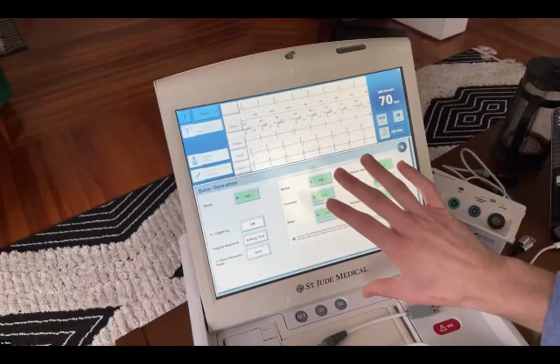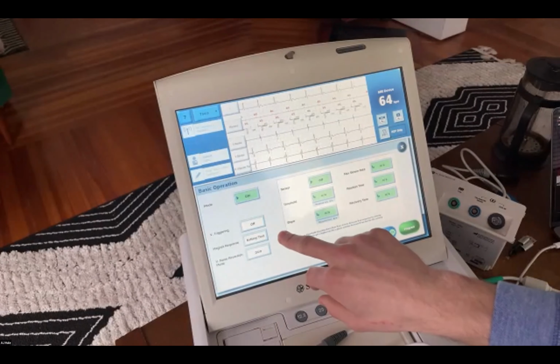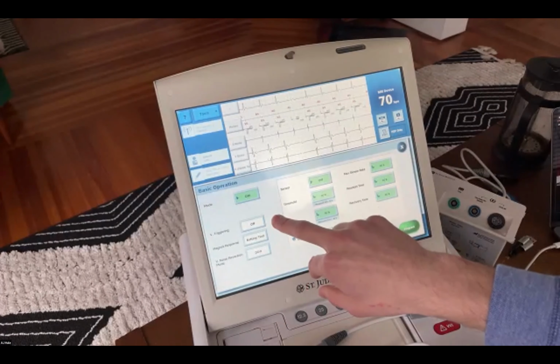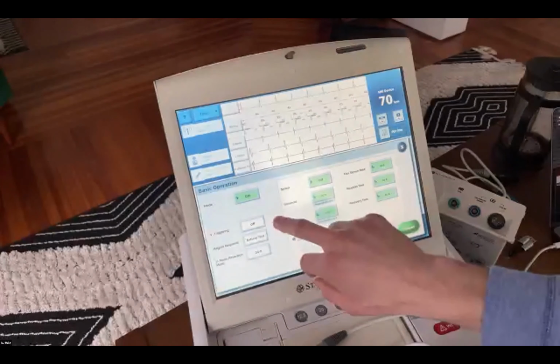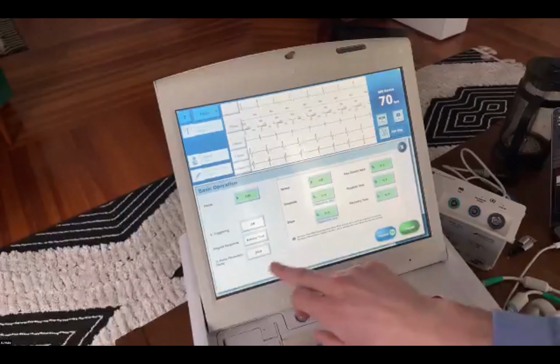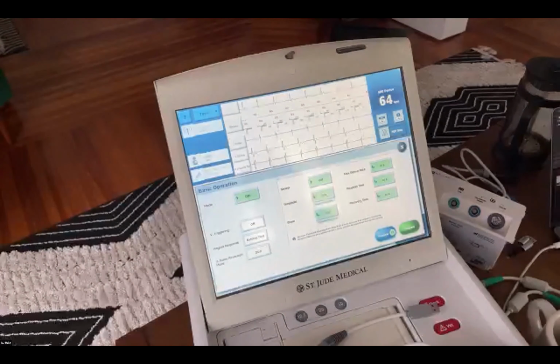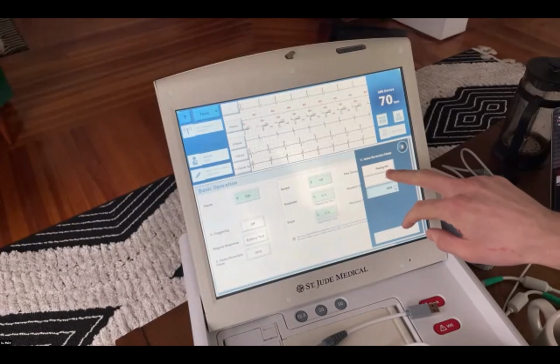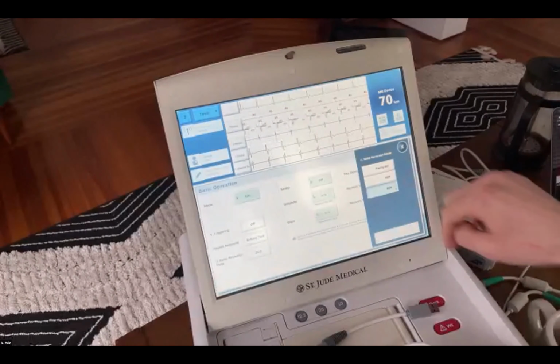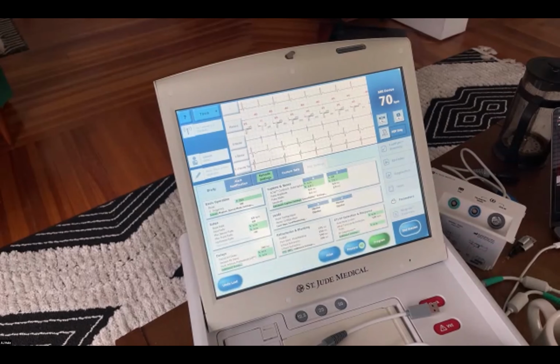Also under your basic operations screen, you have your magnet response, which is going to be the magnet mode pacing. You have your V trigger response off. I don't turn that on unless you have a specific reason to do that. Noise reversion, if a patient's dependent, have your noise reversion set to an asynchronous mode. If they're not dependent, that's at your discretion if you want to leave them at a non-async. But I would say you would probably want to have either pacing off for non-dependent, but for dependent patients, you want to have asynchronous, just so they have that backup pacing.